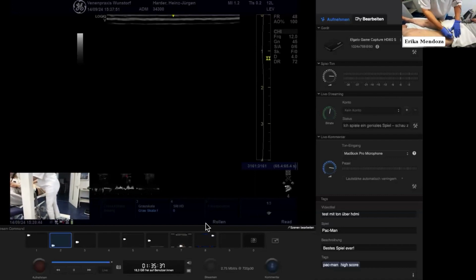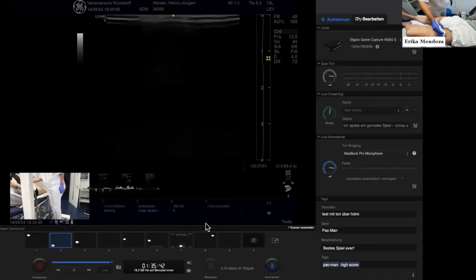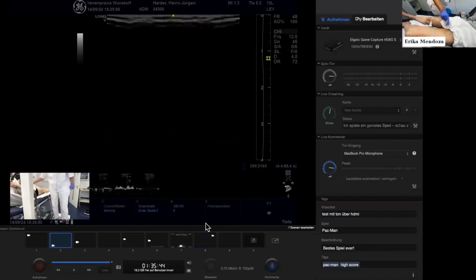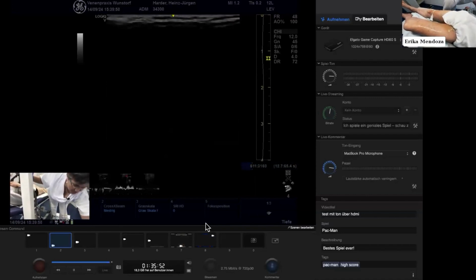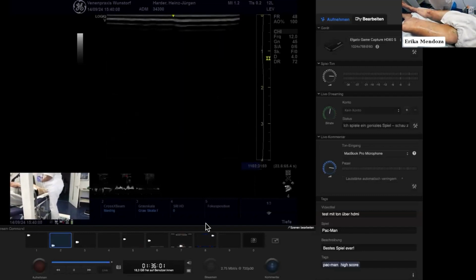Now I will prepare the field. I always put the jelly first, and then I apply from both sides. I apply the, because if you put first the alcohol and then the jelly, it tends to move away. So I like the use of the spray, Dr. Erika. That's a brilliant idea. Where did you get that from? The big spray. Yeah, the alcohol spray.